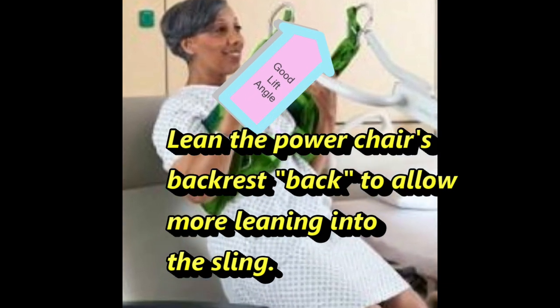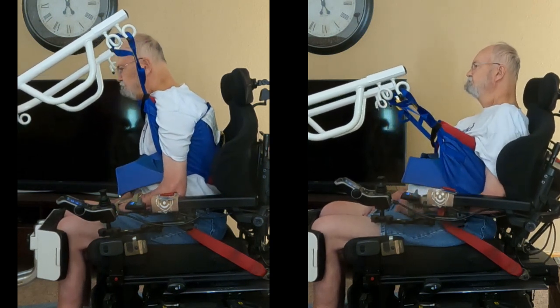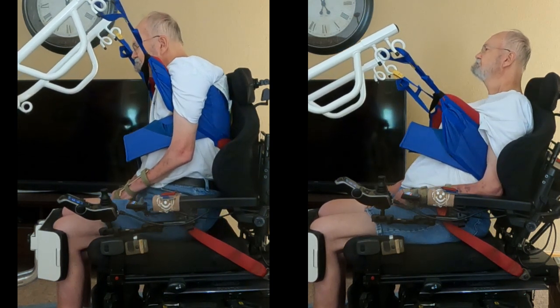For those of you that need a visual of this, compare these two lifts, the video on the left showing the consequences of leaning forward and the video on the right showing a much smoother lift when leaning back into the sling when being lifted.